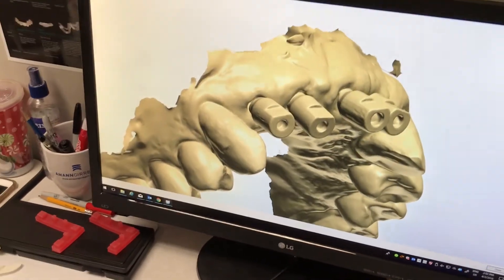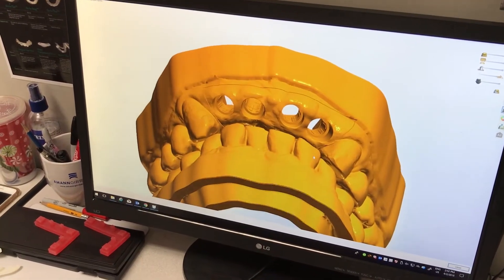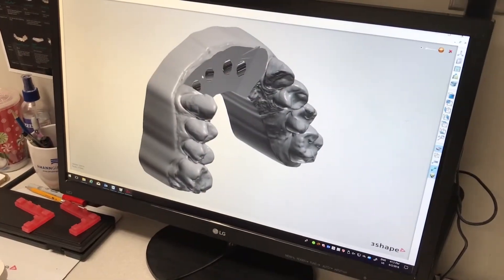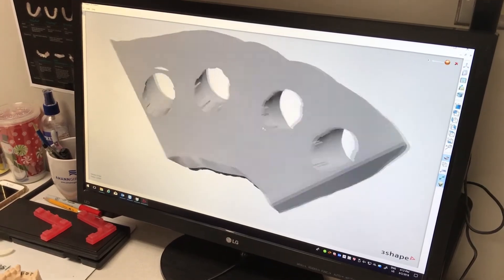Our STL file was provided by the dentist. We edited the file by nesting the implants for the hard model, which we 3D printed. Then we cut out the portion we want soft tissue for and added 4mm supports for printing.